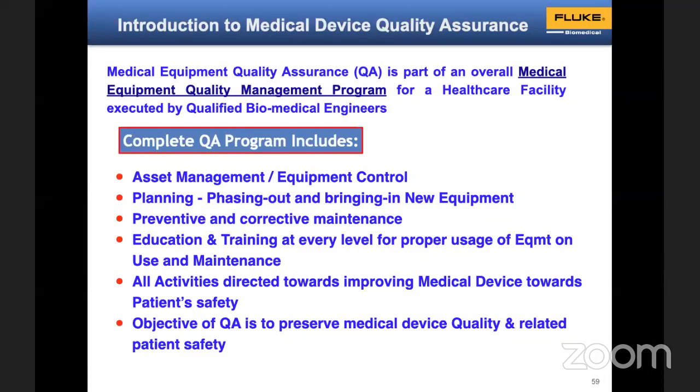Education and training is part of biomedical engineering. You should educate and train the ICU staff how to use the equipment for performance and maintenance, otherwise life will become difficult. You cannot tell a sister anything unbreakable before you complete your word. She will break that into 4 and give it in your hand. So you have to tell how to handle the probes and where to put them: catch the collar and pull out the probe and not by the wire. This education is important so that the failure of the components will be less.